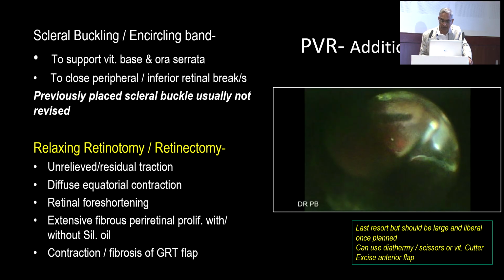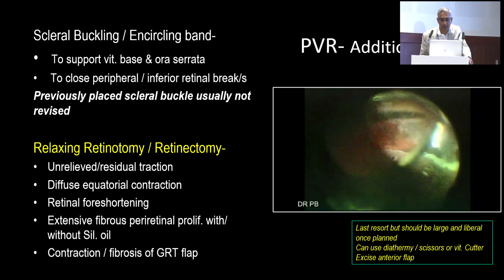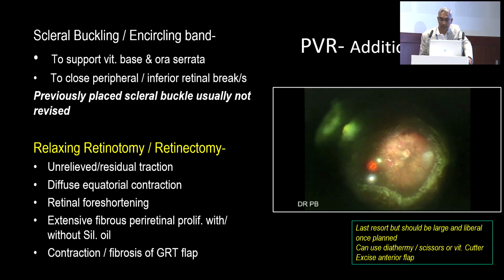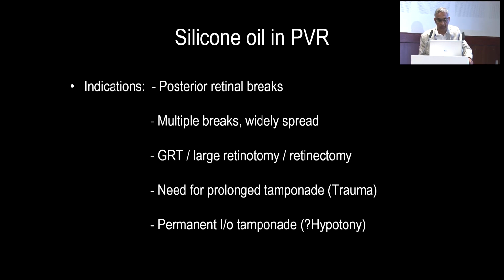But once that is done, we add additional PFCL to settle the retina and subsequent laser. And this is where we added some more PFCL to flatten the retina, and then you do laser all around here. And this was the end of the procedure.